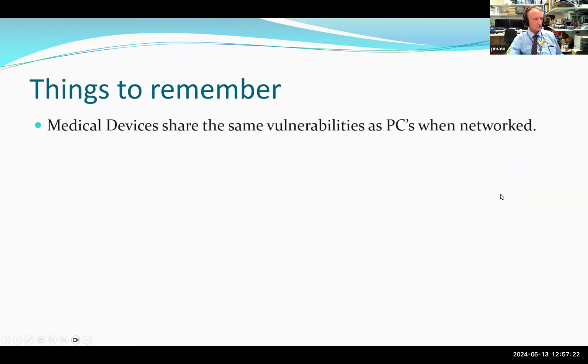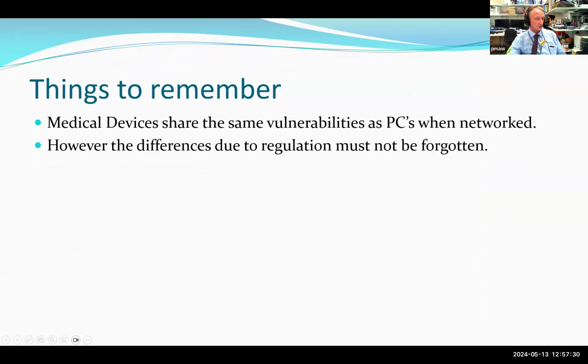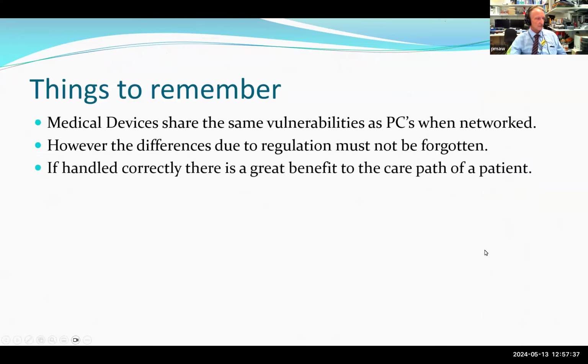So just in summary, obviously medical devices do share the same vulnerabilities as PCs when they're networked. There are differences due to regulation in terms of how you can apply patches, and whether you can use antivirus, that kind of thing. Obviously, if you handle your medical devices on the network, there is great benefit to the care of patients.